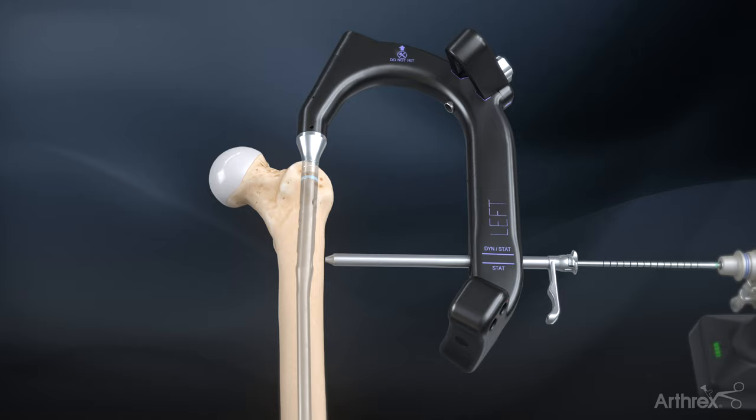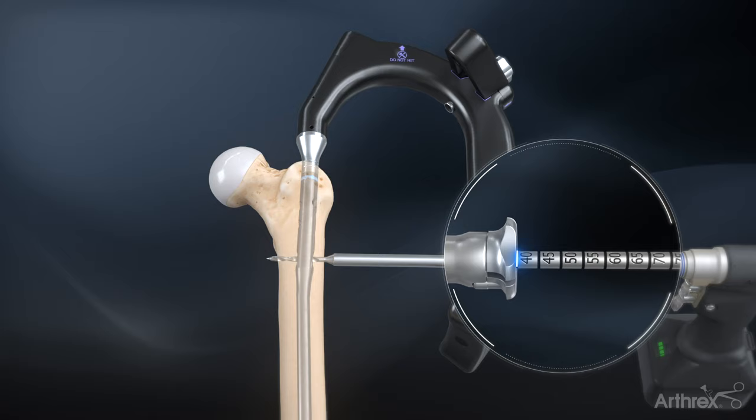Remove the obturator and drill the bone using the 4 mm calibrated drill. Measure the screw length from the end of the drill guide using the calibration marks on the drill.